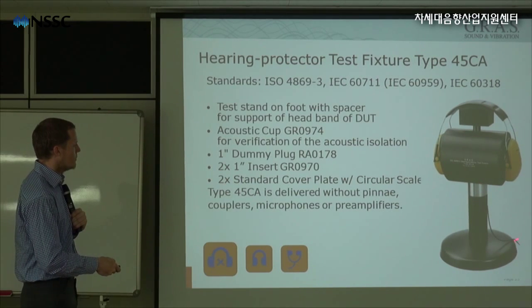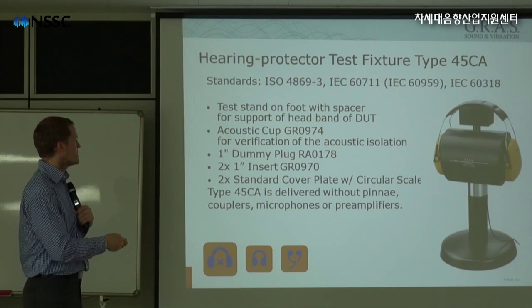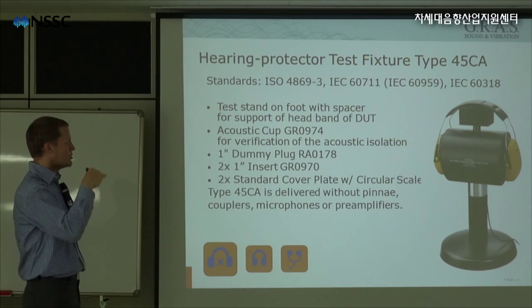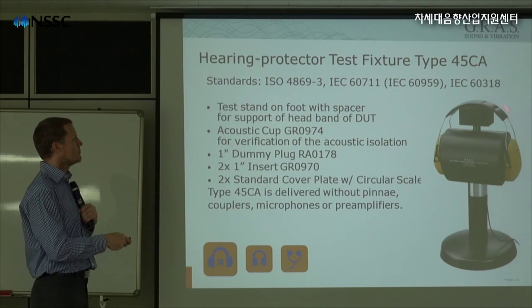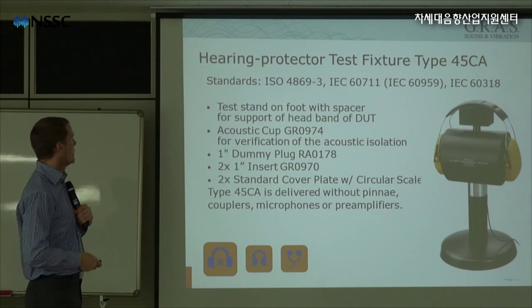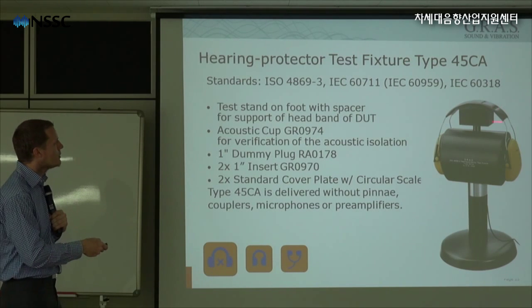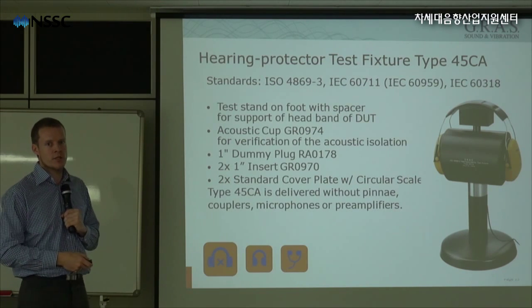So you have the signal going in this way, and the signal that is measured inside is isolated from the outside. So there is a reduction, or an acoustic isolation demand, described in the standard. And this is around 60 decibels or something like that, the reduction required in such a jig.